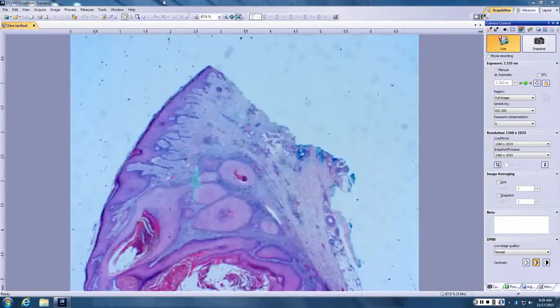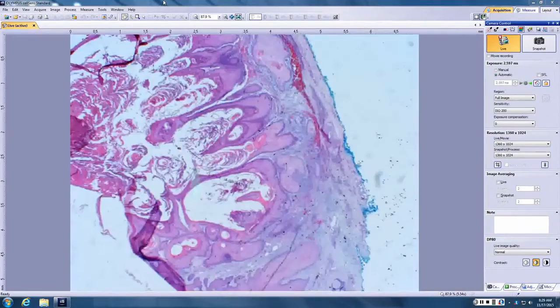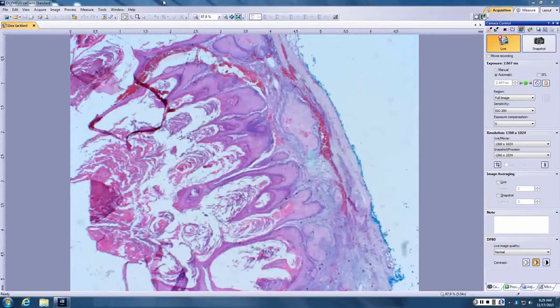Dr. Braun. Looks like a keratoacanthoma. It has glassy epithelium. It is crater-like. It produces keratin. If this were to involute, what would it look like? Then you got your carcinoma. Exactly. So it would keep its crateriform architecture. It would keep the keratin. It would start to fall out, but it would go to skinny epithelium.